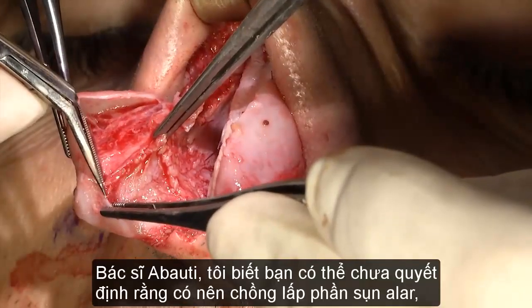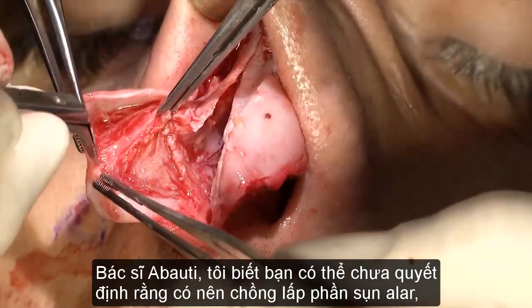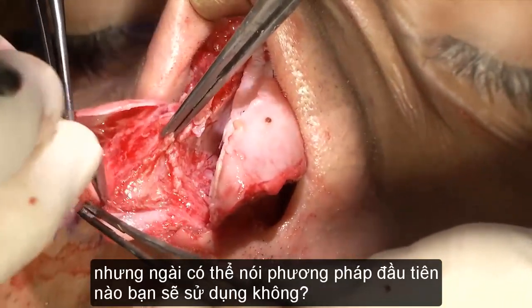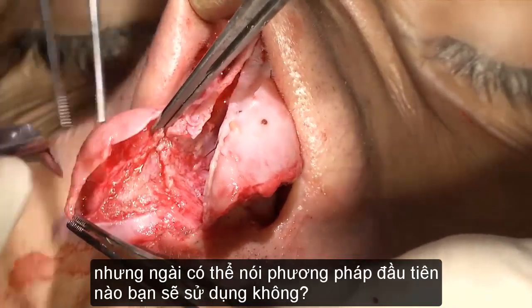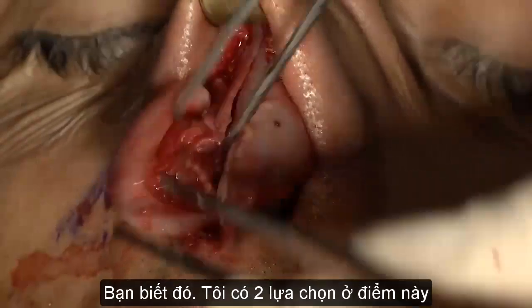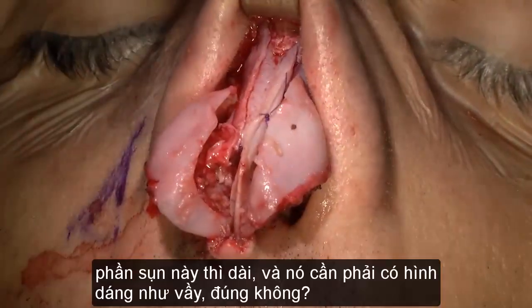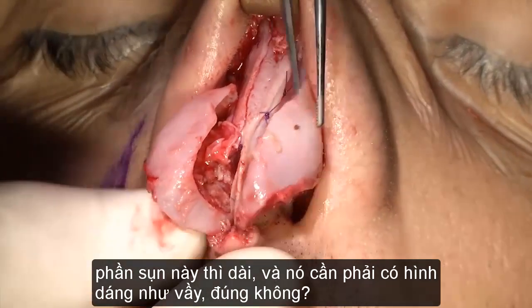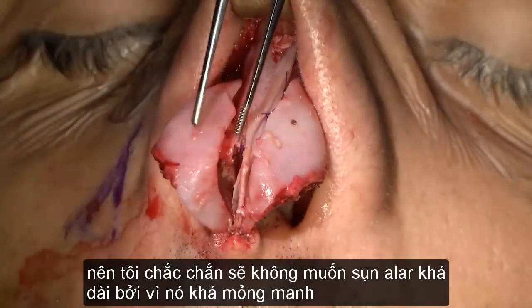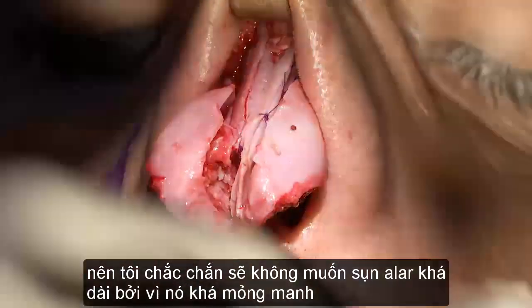Dr. Robotti, I know you haven't maybe decided whether you will overlap the lower laterals, but let's say you wanted to, which maneuver would you do first? Well, frankly, I think I have two choices at this point. They are long, and this tip has to come like this, right? So I will for sure have, I don't want to keep my domes where they are, too flimsy.